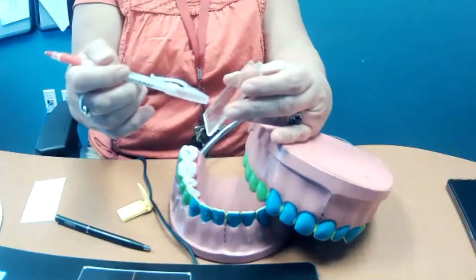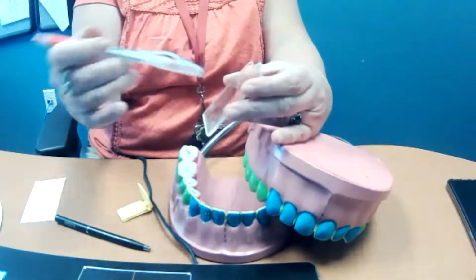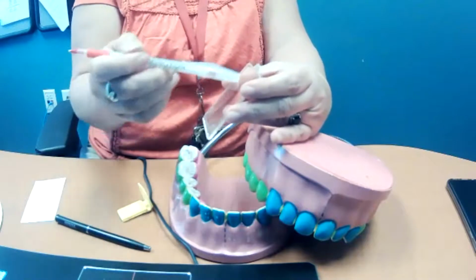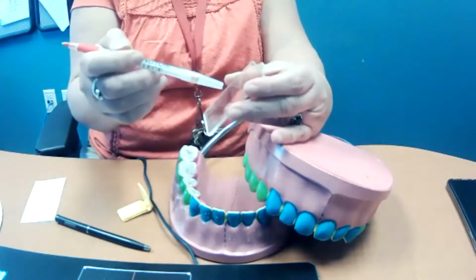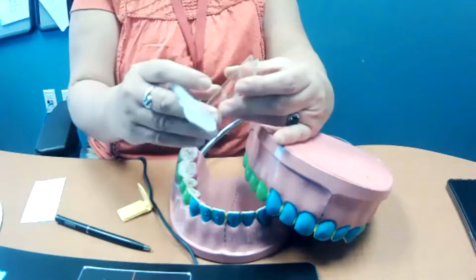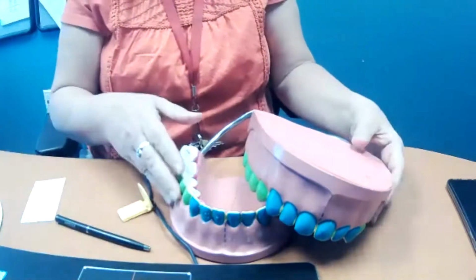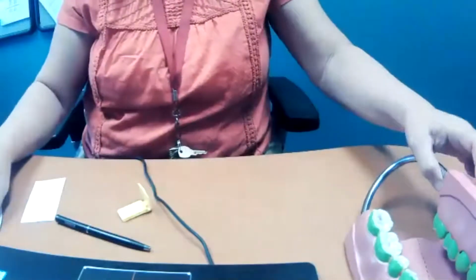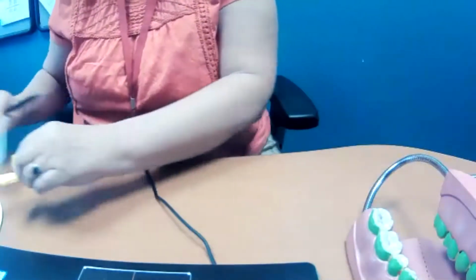Because if they're going to do a root canal on that tooth, they will need to use that X-ray to determine the length of the tooth from the incisal edge or the occlusal edge to the apex, to get an idea of what the length of the tooth is. Does that help? I hope it helps. All right.